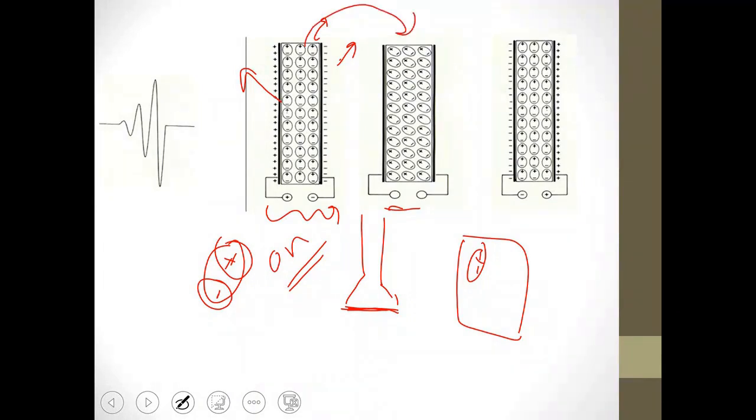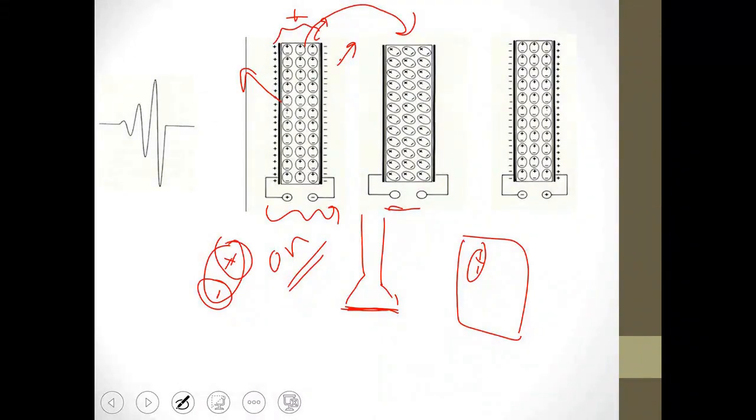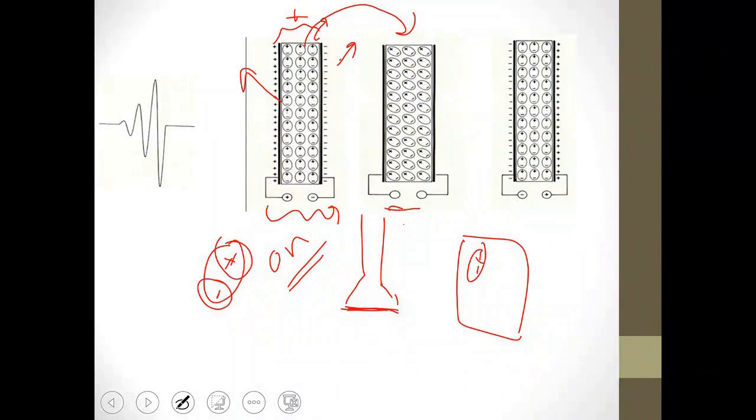So what happened? If you pay attention here, you will find this thickness, which is the distance between the positive and negative electrode. When the electric field was applied, all the molecules were oriented in a parallel manner, so the thickness of the crystal seemed to be reduced in size. When I stopped the electric field, the dipoles relaxed, leading to an increase in this thickness.